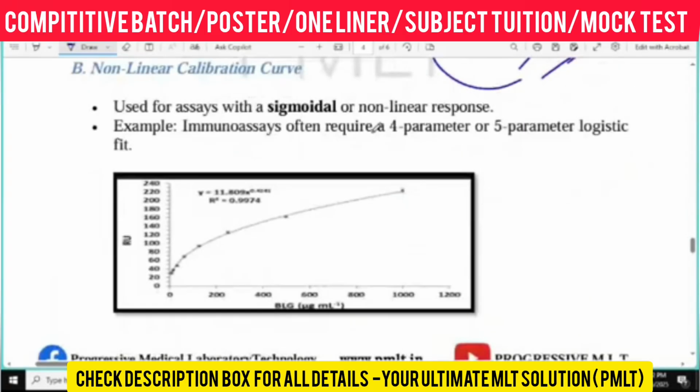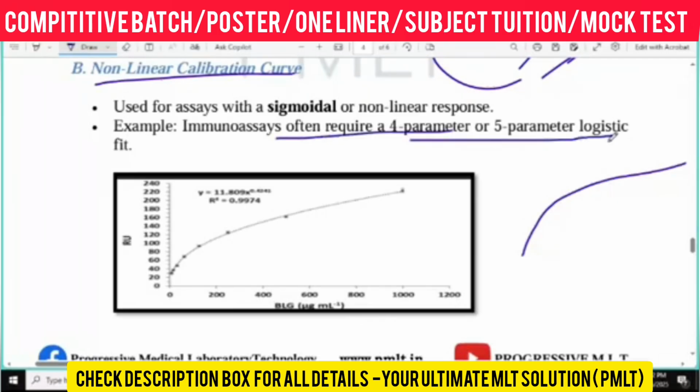See, is this one linear or non-linear? Non-linear, right? Because that is not a straight line. If it's a straight line, then we can say that it's linear, but it is not a straight line. That is a sigmoid-like shape. Immunoassay requires 4 or 5 parameter logistic fit. Immunoassay basically requires lots of parameters. Here, basically, you will get the non-linear curve.